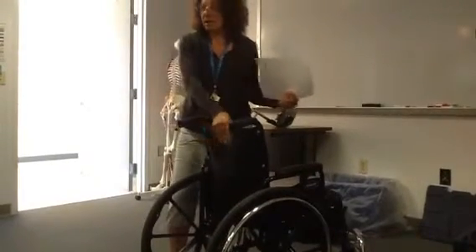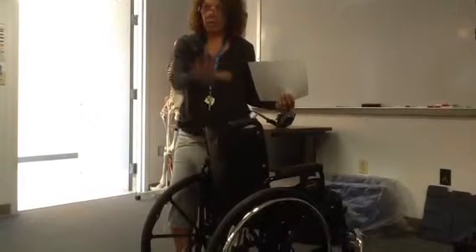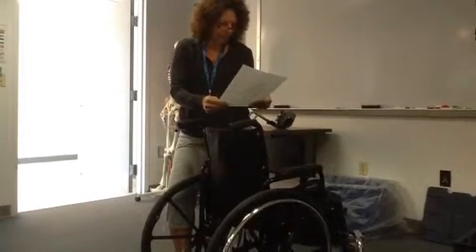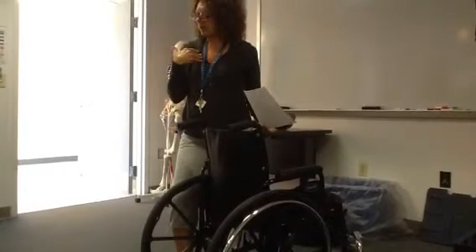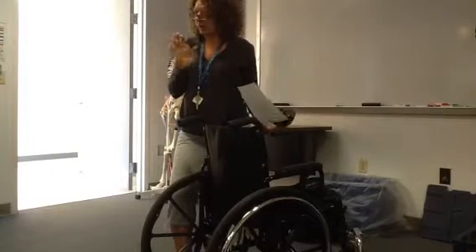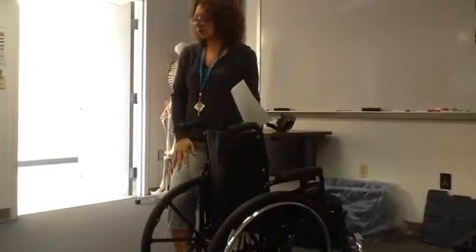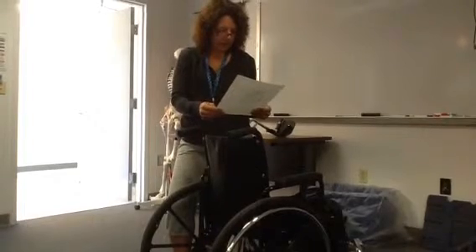Normally the back can be what we call a sling back — nice and soft and moveable — or you can get a hard, solid surface. The solid would be more like what I was describing for the older lady. There's also one called a J back, which is cut out and rounded. It works very nicely.